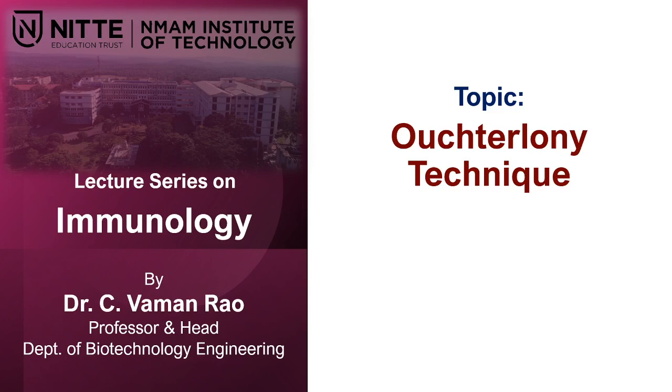I'm going to explain to you the demonstration of precipitin reaction. The precipitin reaction is nothing but the reaction between the soluble antigen and the soluble antibody.